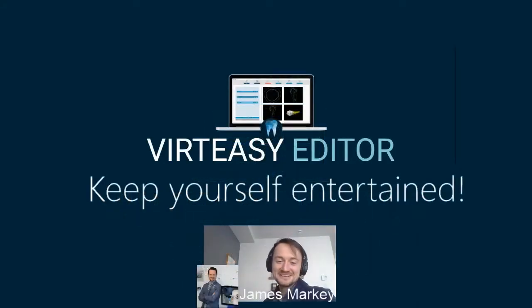So we're going to be doing some live training with one of our wonderful universities to go through step by step how to use Virteasy Editor to complete a workflow with an intra-oral scanner.